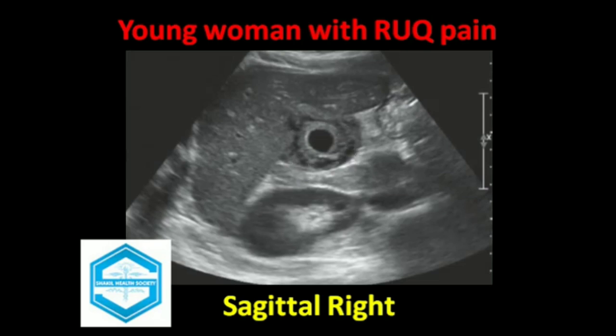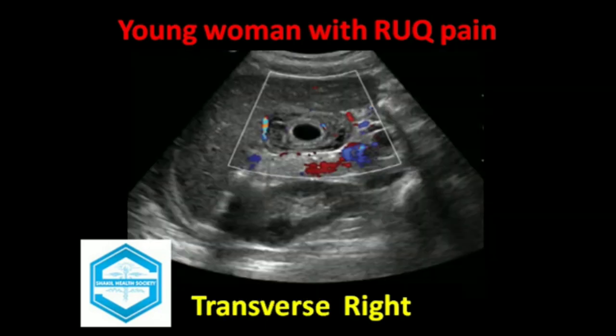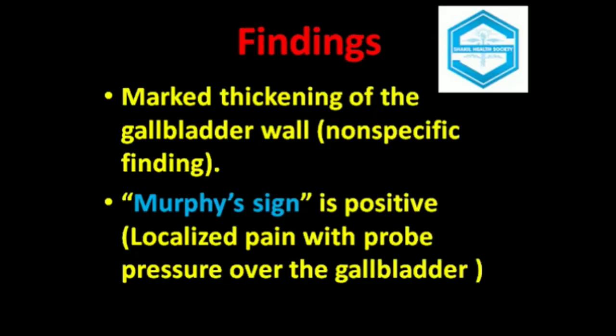By application of color Doppler, there is a little bit of increased vascularity, especially in the periphery surrounding the edematous gallbladder. The findings of these images show marked thickening of the gallbladder wall.